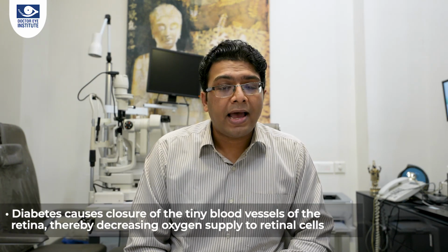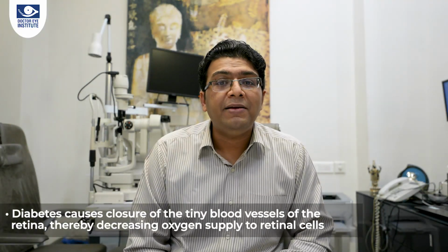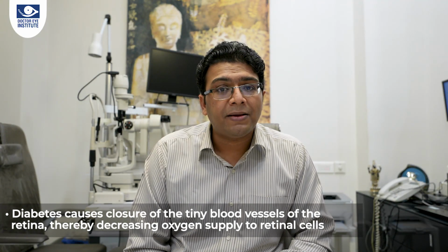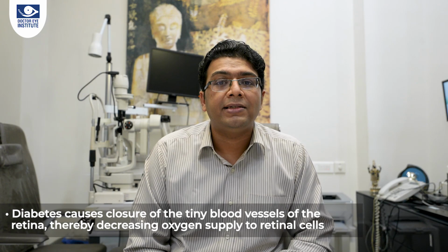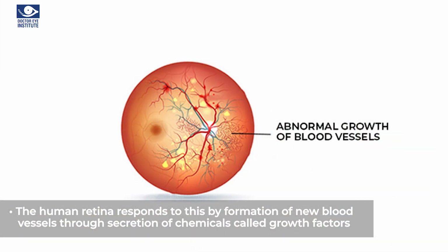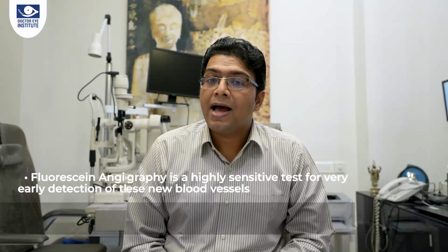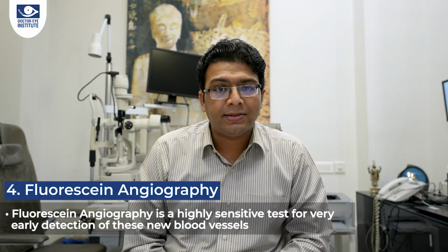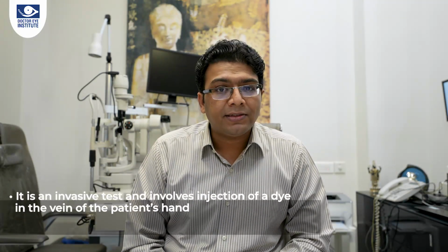Friends, as you may recall from our previous video, diabetes causes closure of tiny blood vessels in the human retina, thereby decreasing the blood supply and oxygen supply to the retinal cells. The human retina responds by formation of new blood vessels on the surface of the retina through the secretion of chemicals called growth factors. Fluorescein angiography is a highly sensitive test for early detection of these new blood vessels. It is an invasive test.